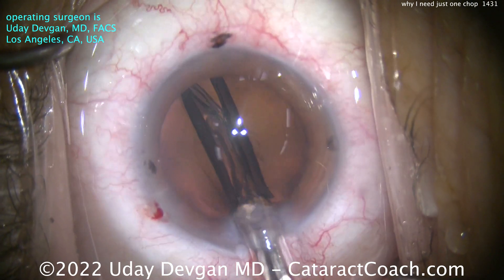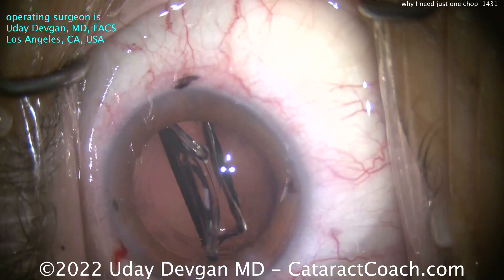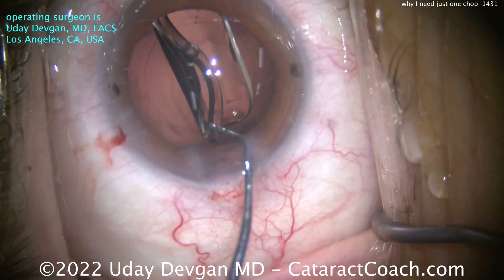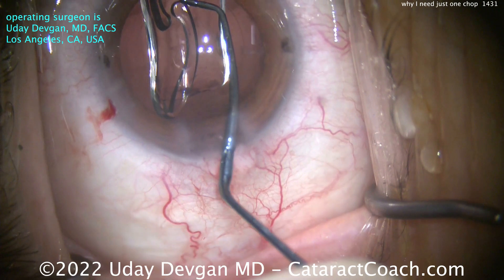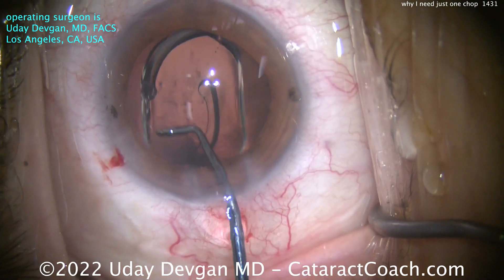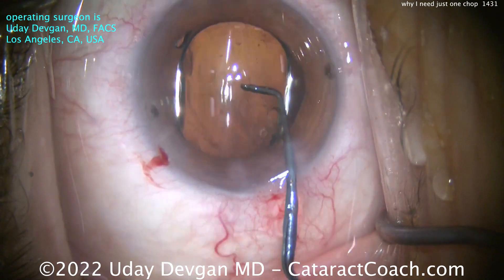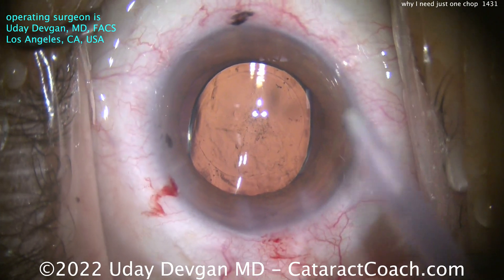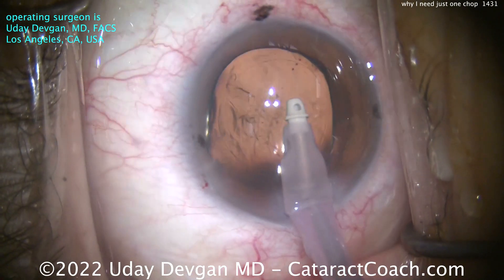It's a single-piece acrylic lens — this is an EDOF lens, extended depth of focus. This is an Alcon Vivity lens, and it's also the toric version, so we'll get that lined up. You can see the toric marks at the haptic-optic junction. I'm going to rotate it a little bit, and our marks on the cornea are just about at the 90-degree meridian, so that's where we'll line the lens up.